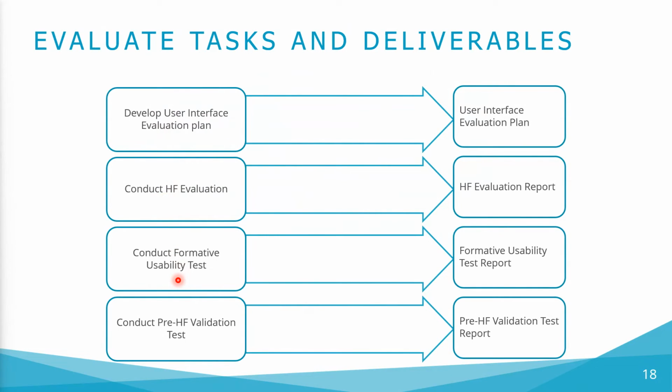Conduct formative usability test. During this step, we will conduct one or more formative usability tests of the product and its user documentation. Formative usability tests involve representatives of the product's intended users, for example, patients or nurses, who perform hands-on tasks with the product, including those associated with critical tasks.